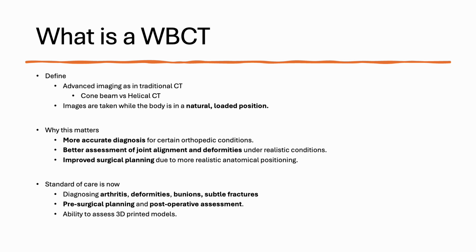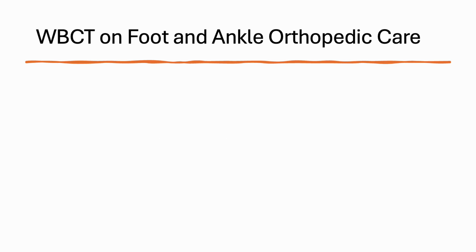The pre-surgical and post-surgical assessments can be, hey, we can try to classify, did we get good correction based on what we're doing? And then honestly, nowadays technology has, and I'll show this, 3D printed models to help you look at this in your hands clinically without the skin. You can see what the bones are doing clinically, and I'll show you an example of that.